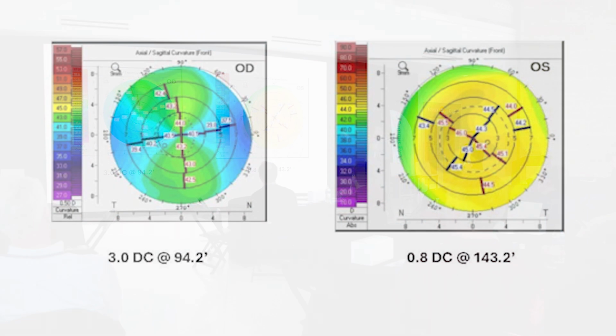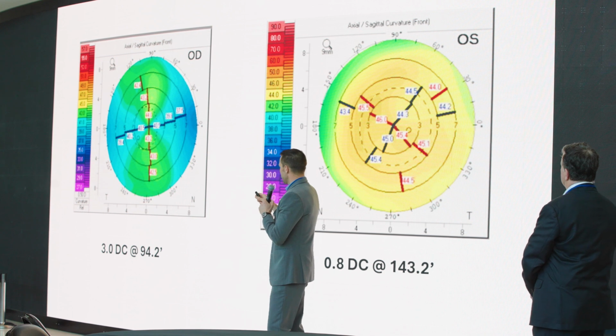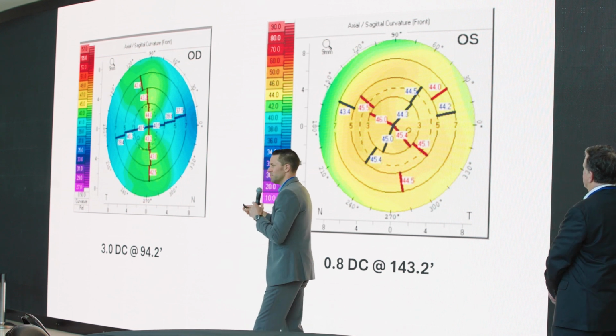So, patient over here, perfectly regular Pentacam. We like to see that topography, the symmetry. That's got 3 diopters of cylinder. Can we get all of that with an astigmatic keratotomy or a limbal relaxing incision? No, but we can definitely debulk it. For that patient, we could easily do a toric lens, though, and we would see the little nubbins on the capsule.